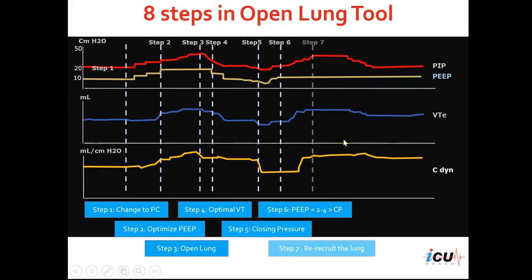The next step would be to re-recruit the lung. We keep the PEEP at the optimal level, then go up on the peak inspiratory pressure once again to 50 centimeters of water, increasing 5 centimeters of water each time. You can notice that the tidal volume and compliance are increased after we set the optimal PEEP. Again, you may notice a decrease in compliance if we overextend or over-expand the lungs.